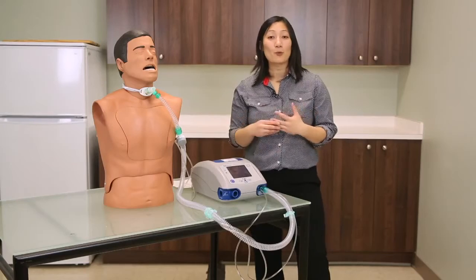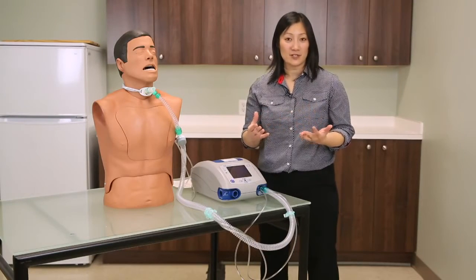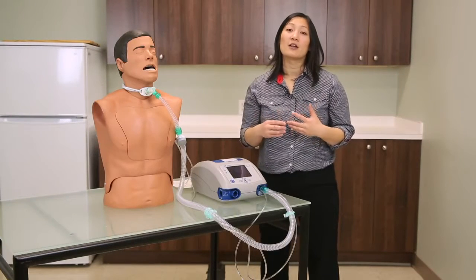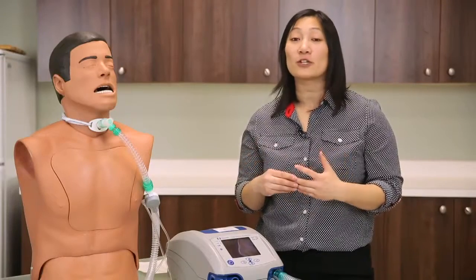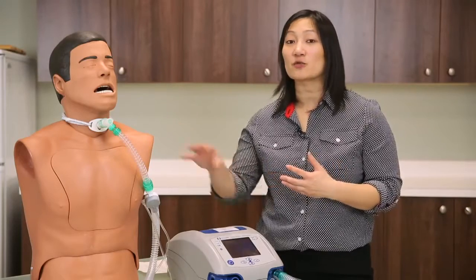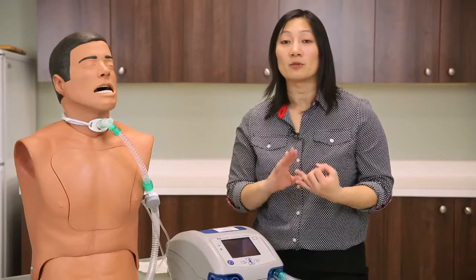In summary, an appropriately set low pressure alarm is essential for your client's safety. An inappropriately set low pressure alarm can lead to death. The only way to ensure that the low pressure alarm is appropriately set is to simulate a disconnection from the client to the ventilator and ensure that there's a visible and audible alarm.